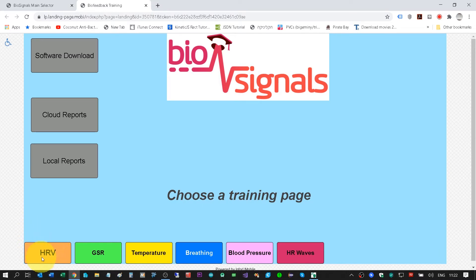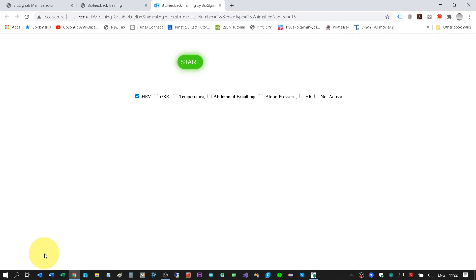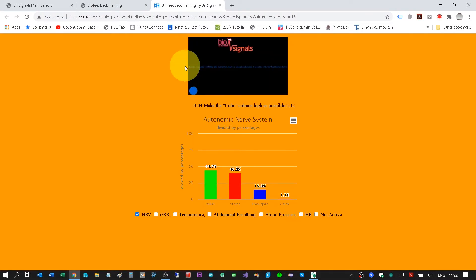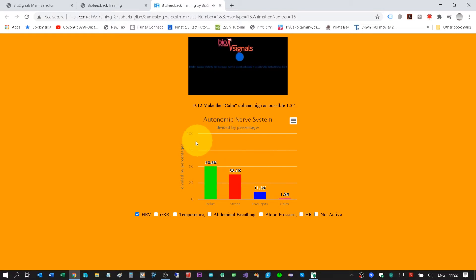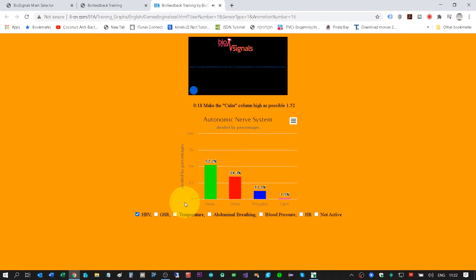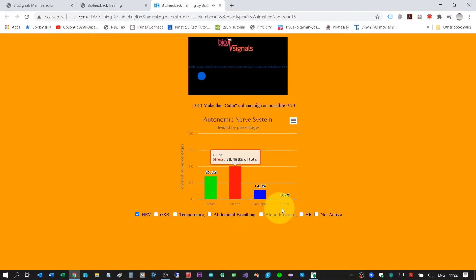If I would like to do HRV — Heart Rate Variability — I will click here and then click the Start button. The video will run. These bars are the heart rate variability analysis. We can see the low frequency relax level. The result is low frequency divided by high frequency. The mission is to make the calm bar as high as possible.